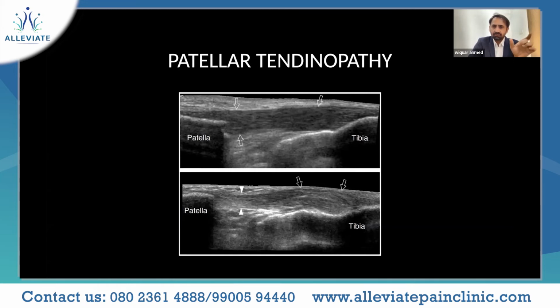And then when you slide it down, you can actually visualize an area which is connecting, like a sling, your patella and your tibia, and that is your patellar tendon.